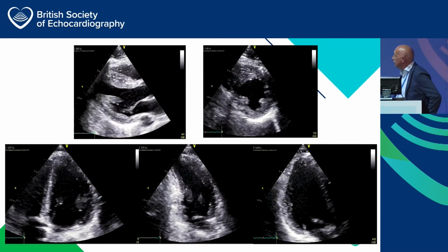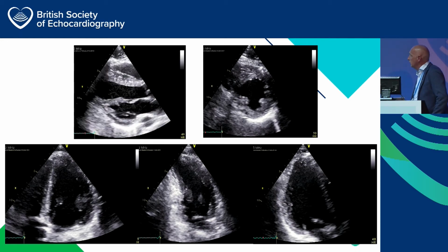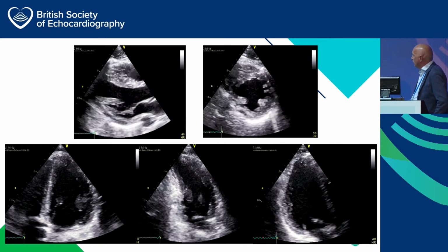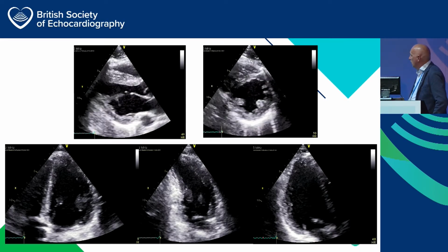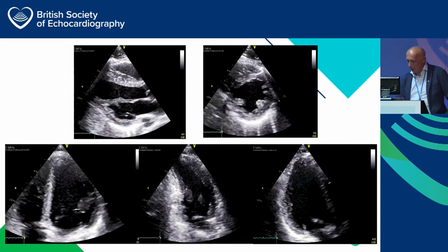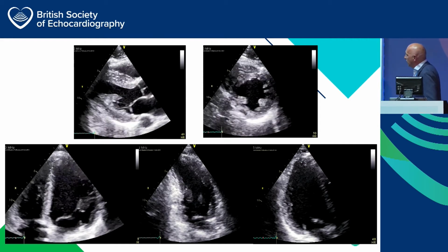This is a 3 months follow-up echo. So normal ventricle here, basal and mid portions working well. Mid cavity, nice contraction. Apex, come on, it's going to work. I might have to press it. Yeah, there you go, it works. So again, mid and basal segments.